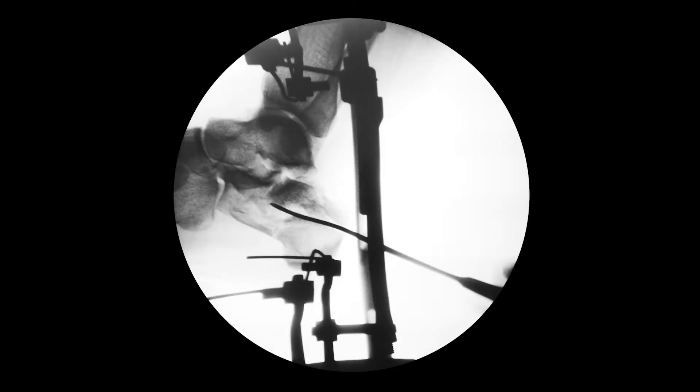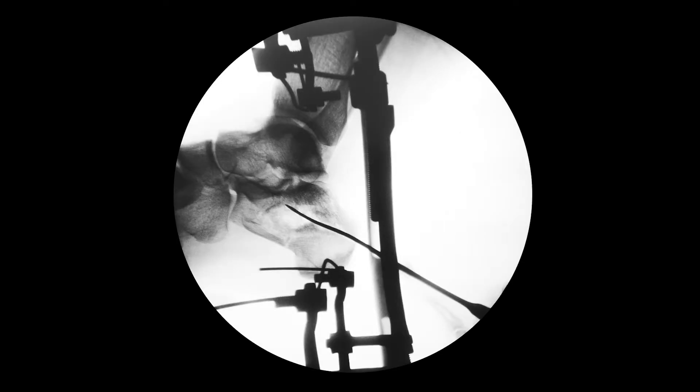Through the fracture line of the tongue-type fracture I introduced an elevator and lifted fragments of the articular facet, leaning on the calcaneal tuber.